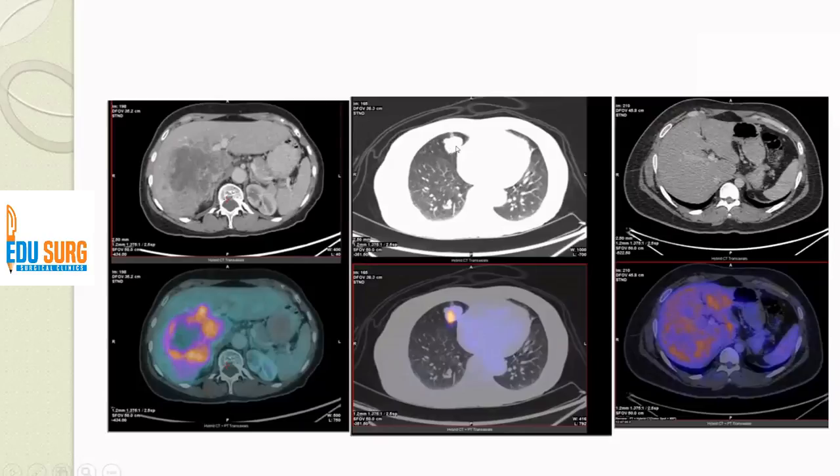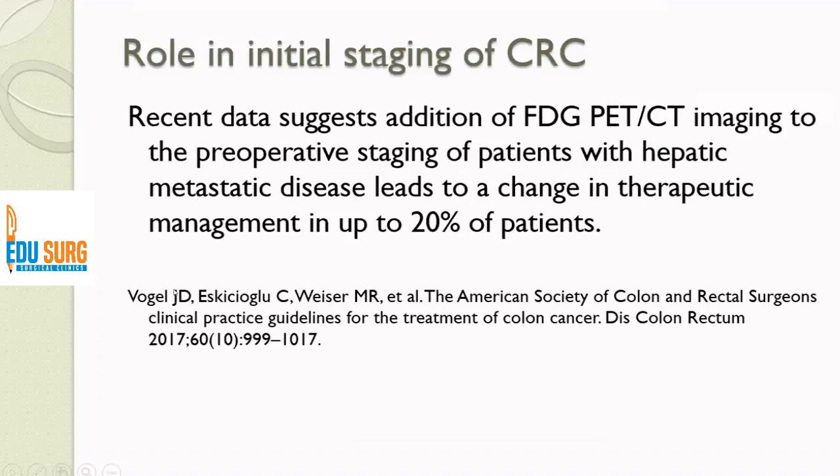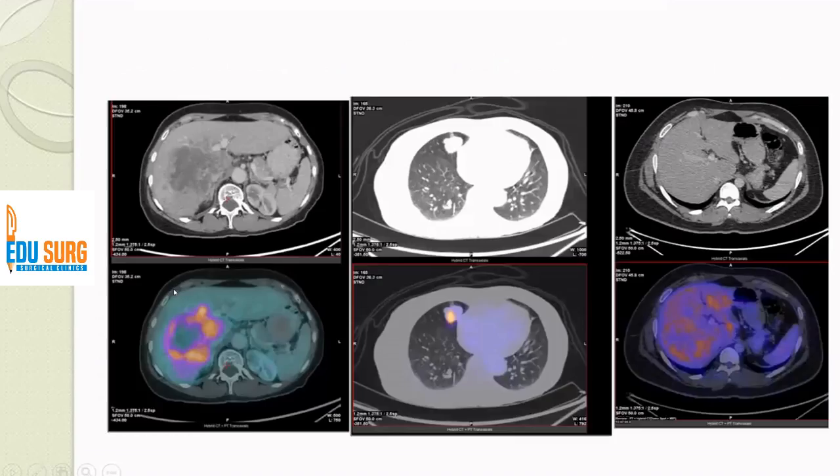This slide shows the lung metastasis seen here on the CT, which is metabolically active on the PET scan, showing high-grade glucose metabolic activity. Here is a large hepatic met showing area of central necrosis, where you see absence of metabolic activity. So the PET-CT is useful in characterization of intratumoral variation as well. We can see that this is the viable part of the tumor at the periphery, and this is a centrally necrotic, acellular, ametabolic part.